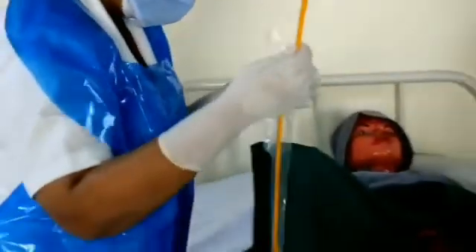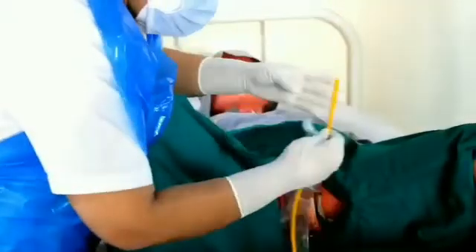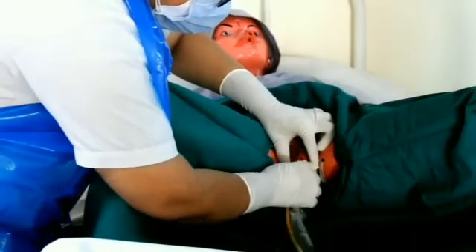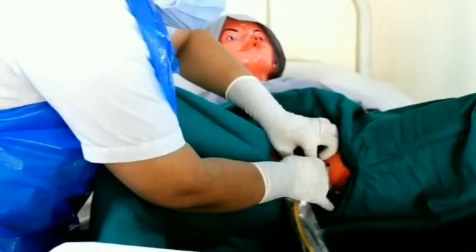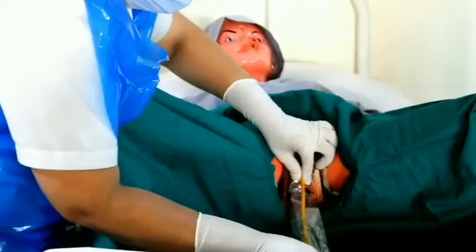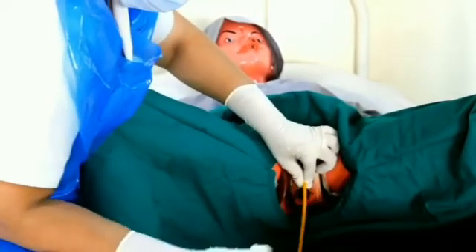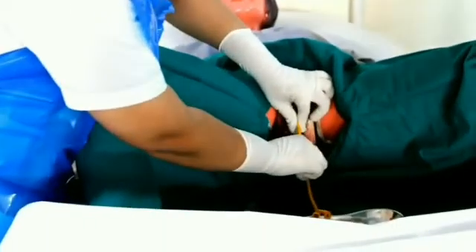and identify the urinary meatus. Be careful not to insert the catheter into the vagina. Now, gently insert the catheter into the urethral opening until 1 to 2 inches. Open up the wrapper and check for the flow of urine to ensure that the catheter is inside the bladder.